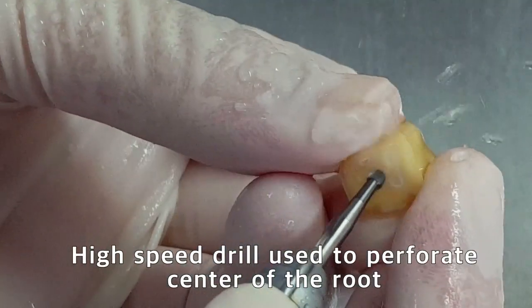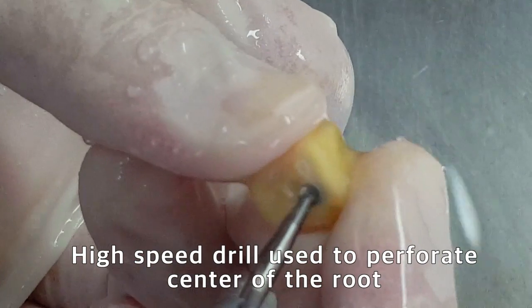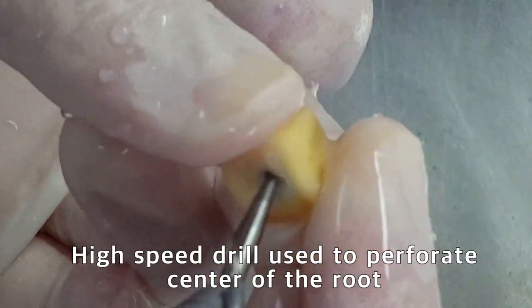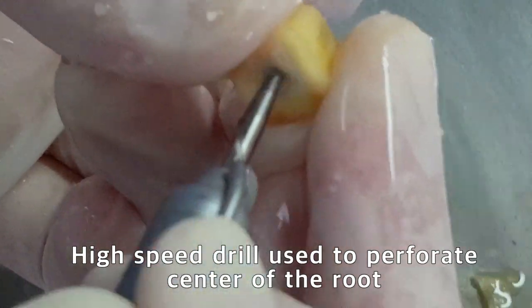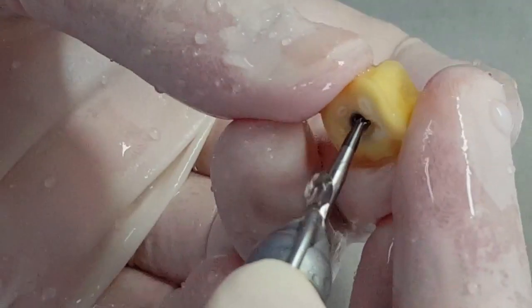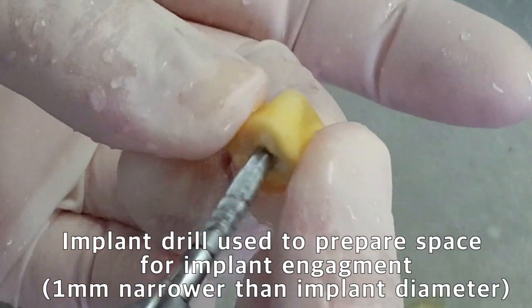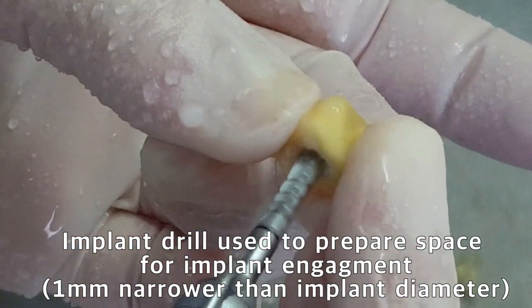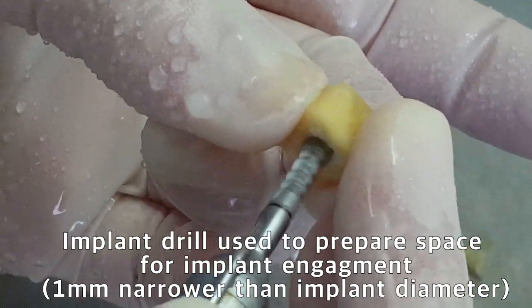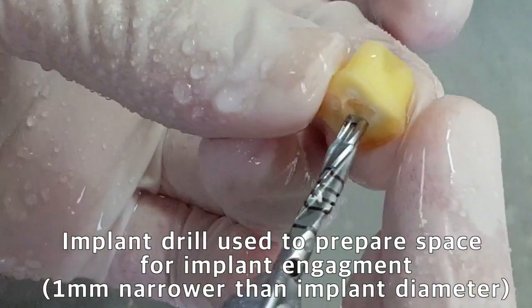A hole is formed in the center of the root for implant placement using a 2-millimeter-wide round carbide bur. Complete the preparation of space for implant engagement using an implant drill that is 1 millimeter narrower than the implant diameter.